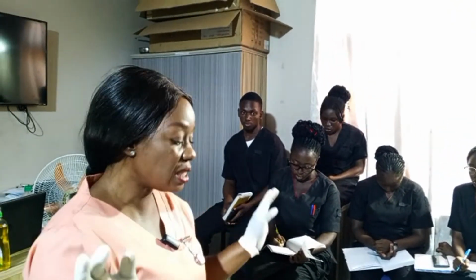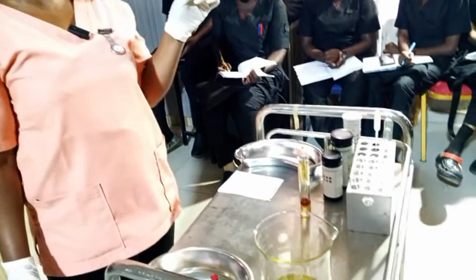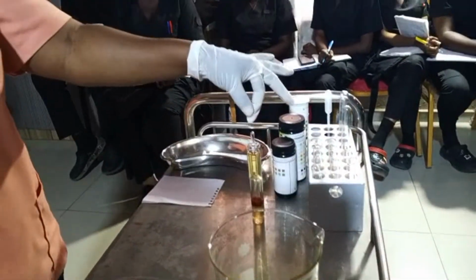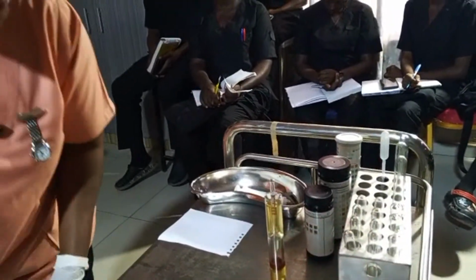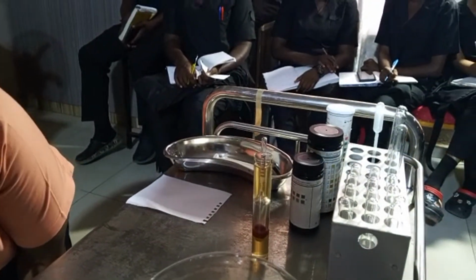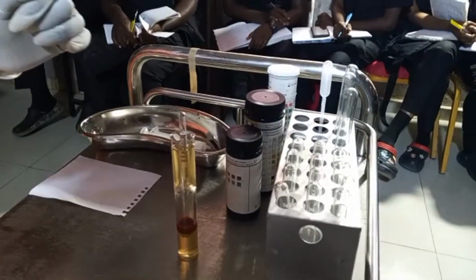So avoid that, just look at it at eye level. Remember, there are some graduations on the urinometer, right? Immediately you dip in the urinometer, you use your eye and look at it, and read the specific gravity of this urine. Let me teach you how to do that.